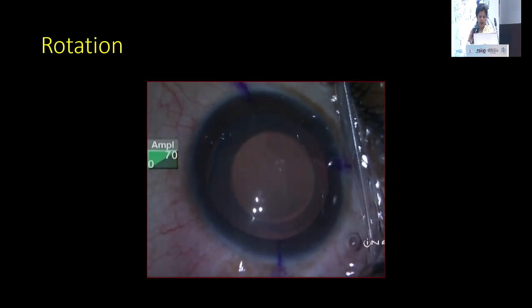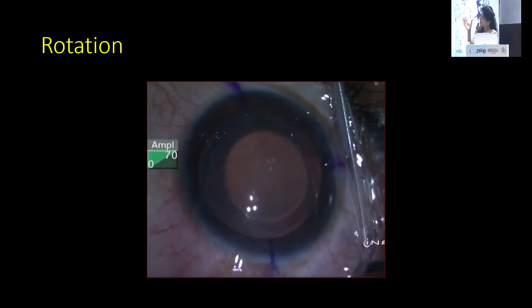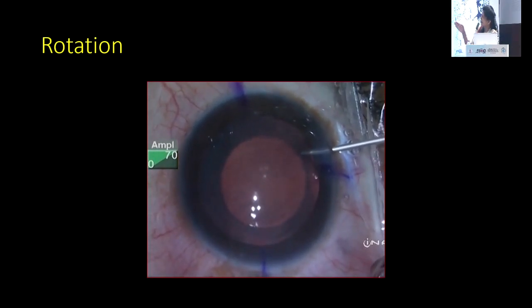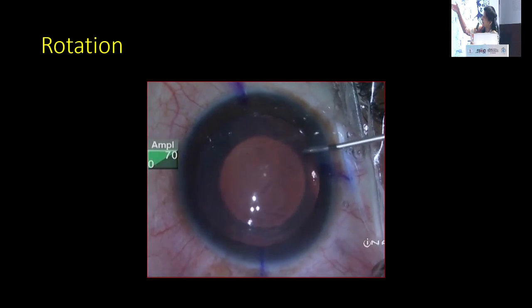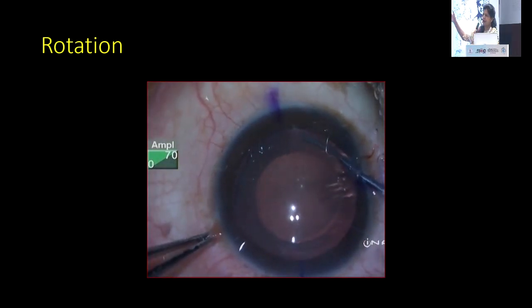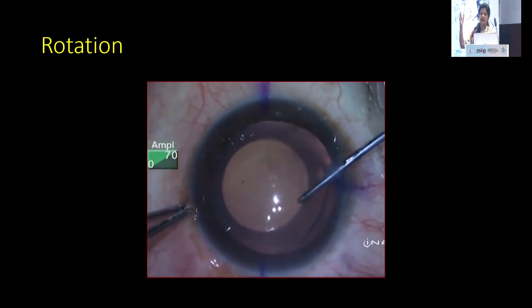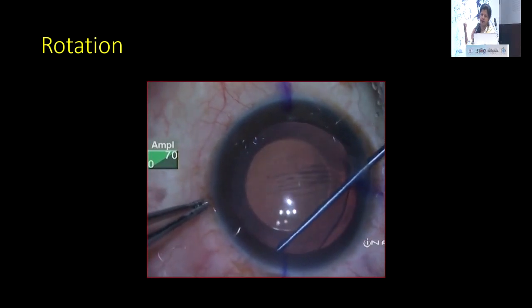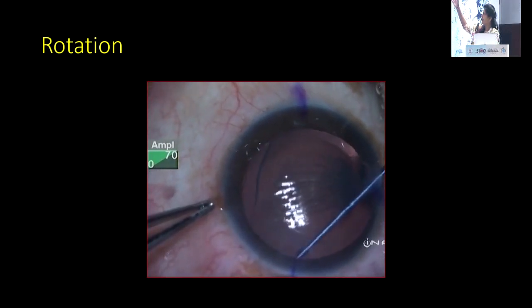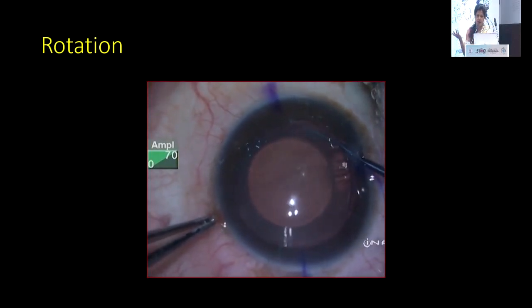left behind. Now coming to this patient, this was a patient post-trauma whose ICL had rotated. You can see that the markings where the re-rotation is attempted is very different from the way the ICL is oriented, approximately 30 degrees away. So that's very important. For each degree of rotation, there is a 3.3% loss of dioptric power, especially in a high astigmatic ICL, and that's very important. So if the lens is rotated by more than 10 degrees, then that's 33% loss of power.